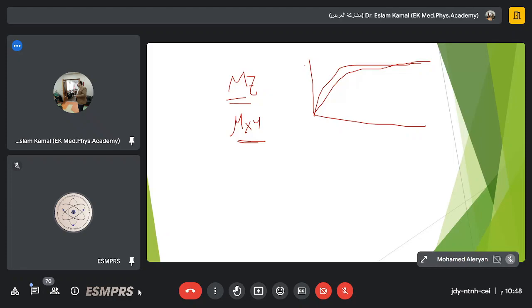And you are going to record the signal here, for example at a long time after turning off the radio frequency pulse. This MZ will not induce any electric signal. Now MZ has a higher value. If you select this time, you get the point of what I'm talking about?